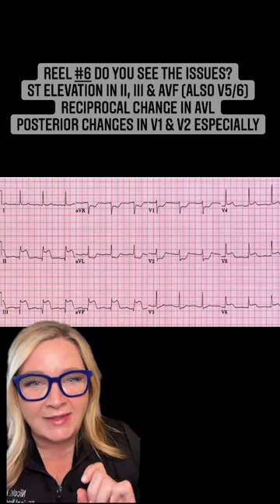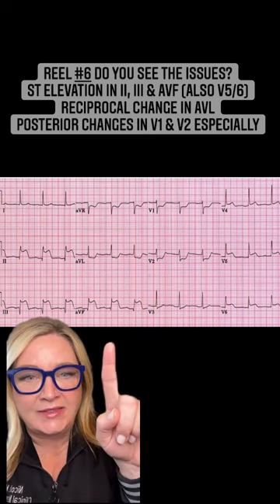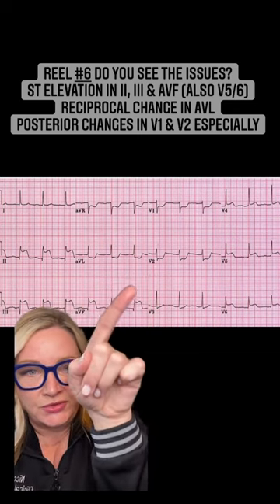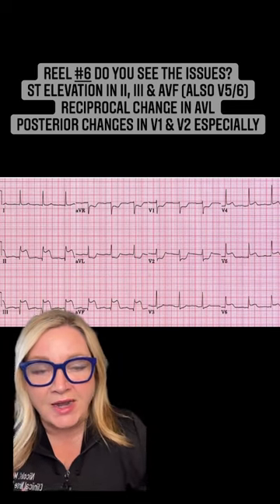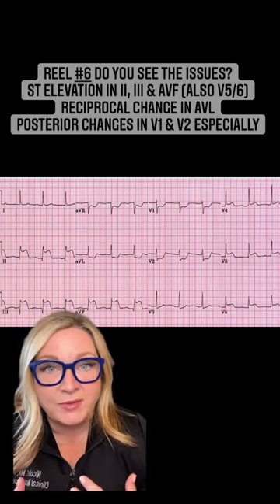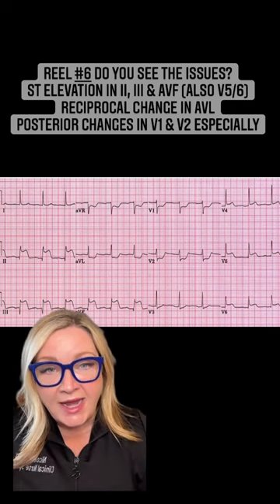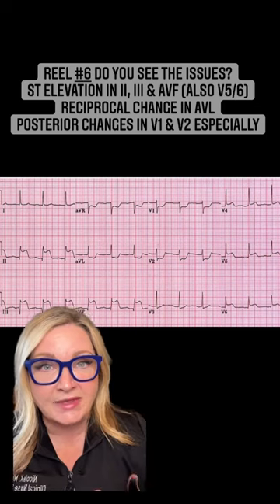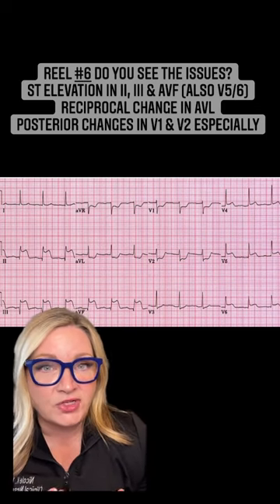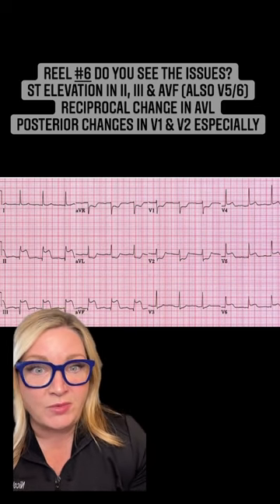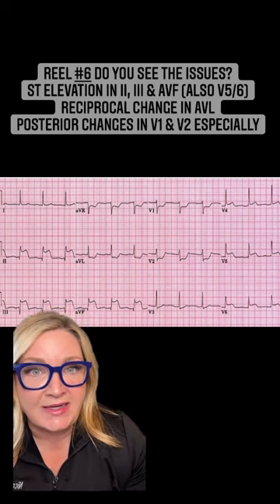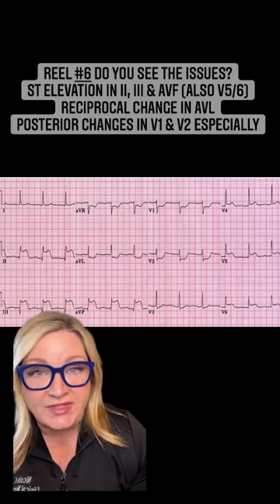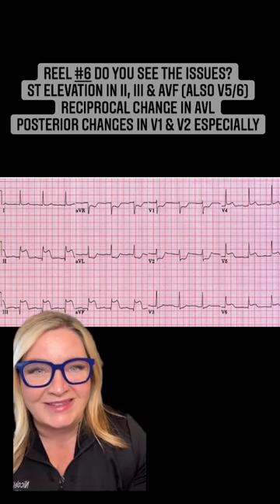To find a posterior wall MI, let's go to leads V1, V2, and V3, and we're going to look for the reciprocal change. The posterior wall is on the back and we don't have leads on the back, so we're going to find the reciprocal change in V1, V2, and V3. And what we see here is significant ST depression, which signifies there's posterior wall involvement.